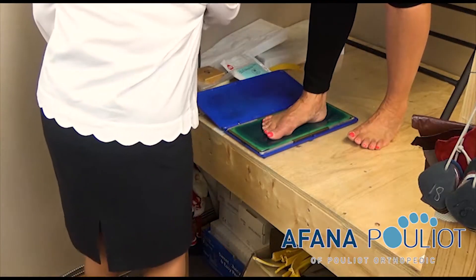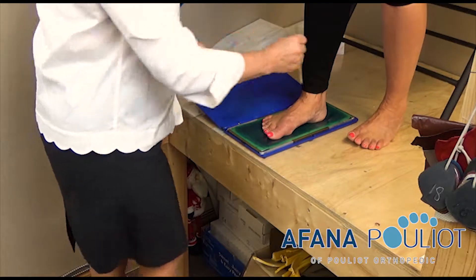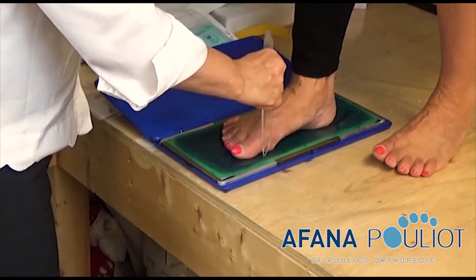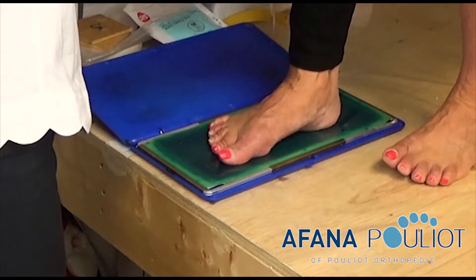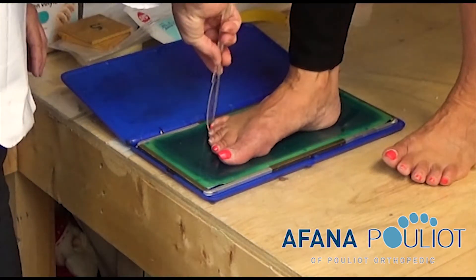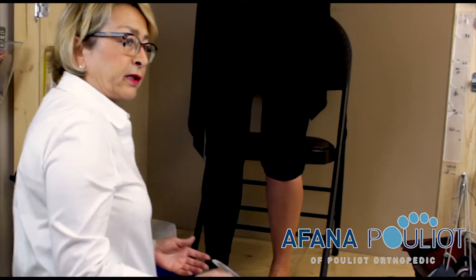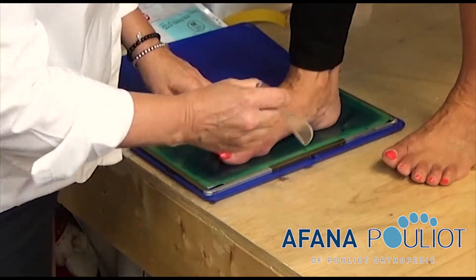Once you have that, you use a tracer — I use a simple knife — and I trace around the foot at a 90 degree angle. This is very important, because you want to get the perfect sizing of the foot's soft tissues. If you have a wider angle, then the measurements will indicate more soft tissue than there really is, and in the making of the footwear, that's going to be taken into consideration.